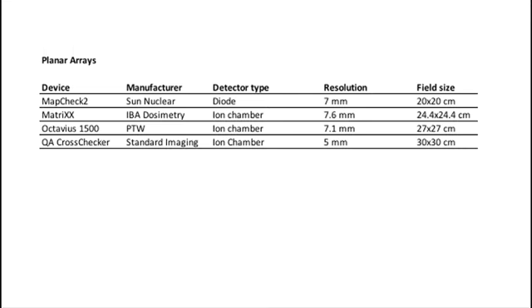And then these planar arrays, you can put them either directly under the beam, maybe with some phantom material on top of it, or you could put them inside a specially designed phantom, like that might be, say, a cylinder or something, and then if you correct for the angular response of the detector, you could do an arc around the detector and get a good reading.